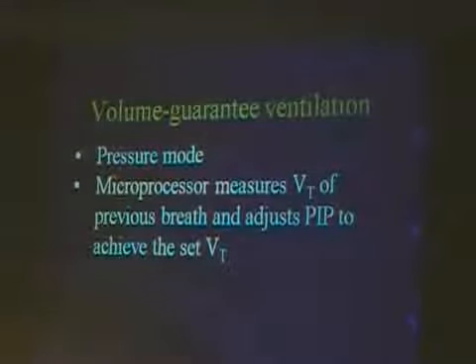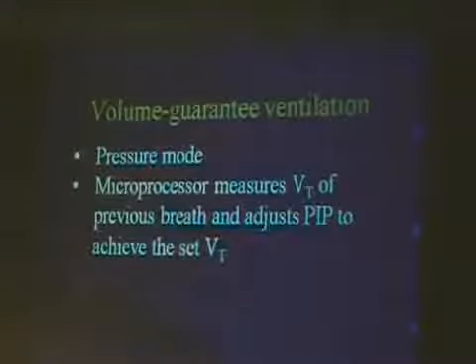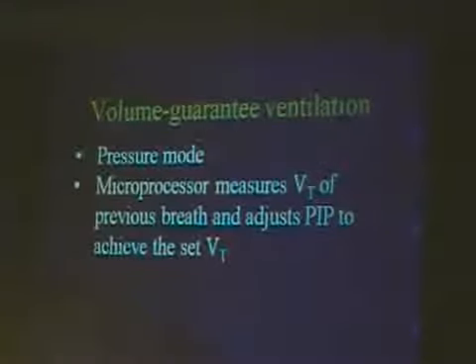Is it done breath to breath? It's breath to breath. And it depends on the ventilator, whether it's the previous breath or the previous series of breaths. And I don't know how the Avea does it, because I haven't been in service on it yet. But either one or several previous breaths are averaged. It's a moving average. And the ventilator then adjusts the pressure to keep your tidal volume where you want it to be.